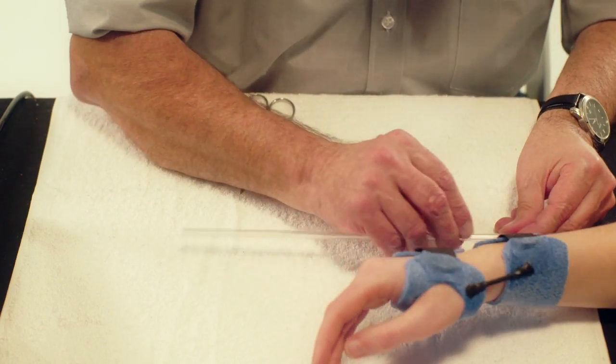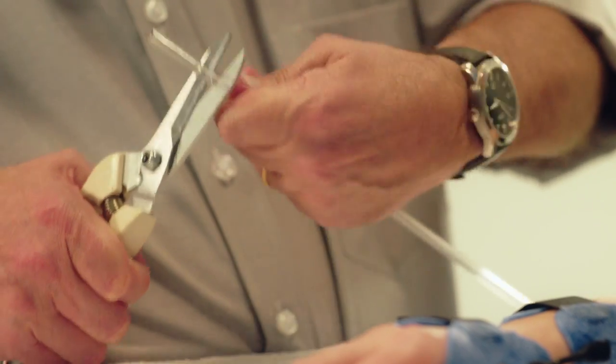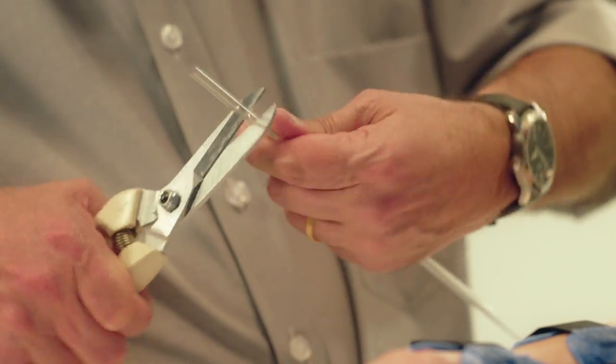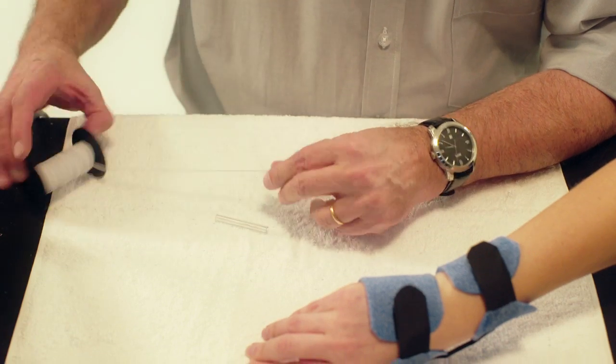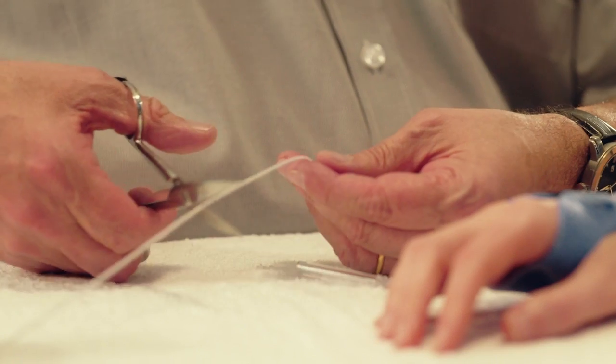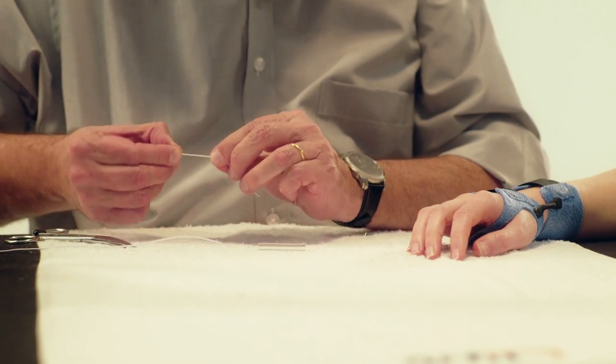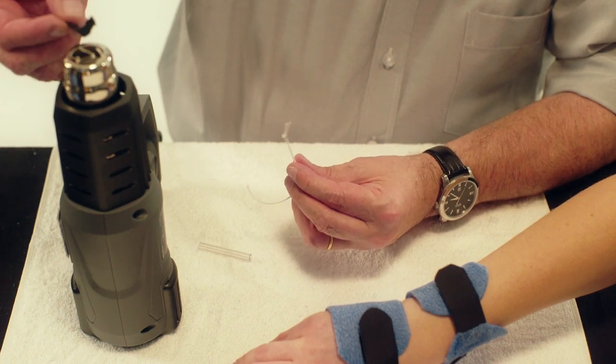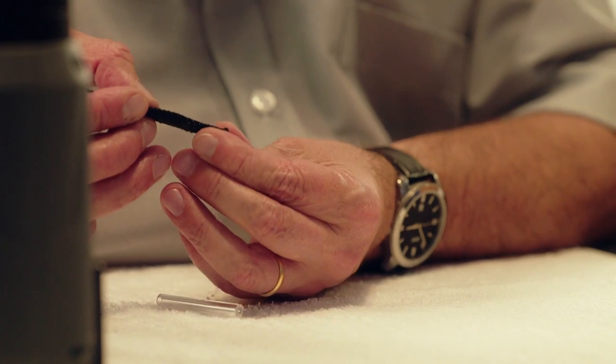Take one Orphi tube and cut the Orphi tube to the right length. Take a piece of elastic thread and make a knot on one end of the thread. Heat a piece of Orphicast with the heat gun and roll this over the knot to secure the knot.